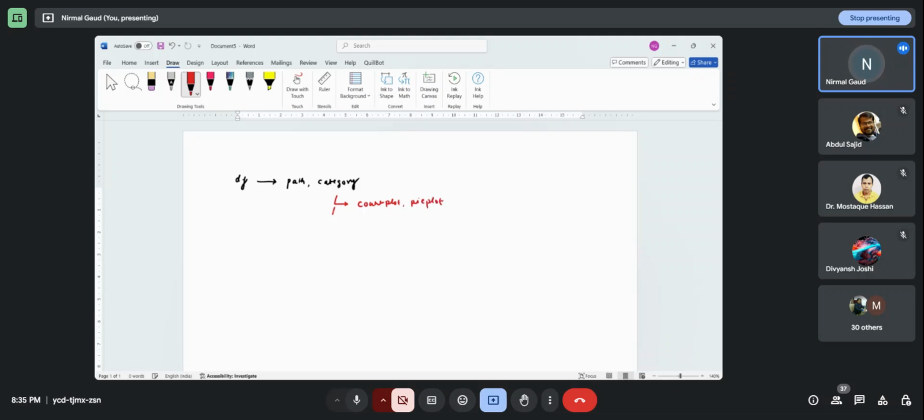Then I also plotted five images of each category. Then I performed random oversampling. We had a good discussion on oversampling because the question asked to me was, "Sir, you did the augmentation."